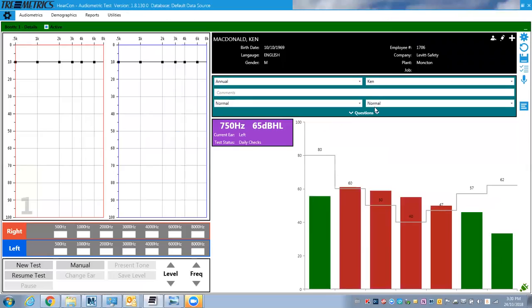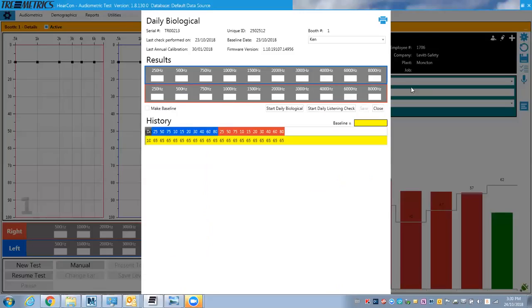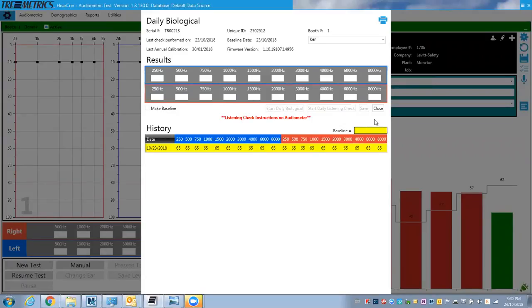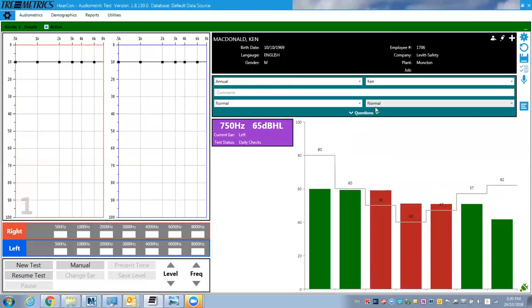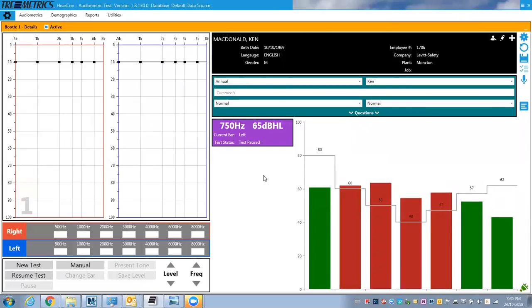The other one here is the daily listening check I want to show you. Basically it's more of a test to find out if the wires are staticky or if there's issues with the headphones and stuff like that. So it's kind of a secondary test. I won't go through it right now, but it's a nice feature that that's actually built in.